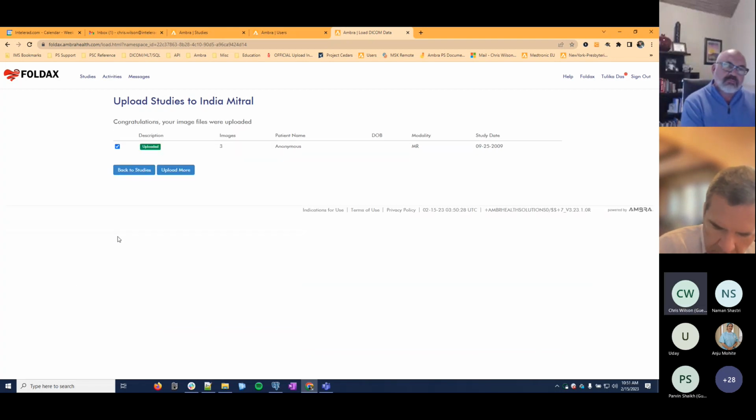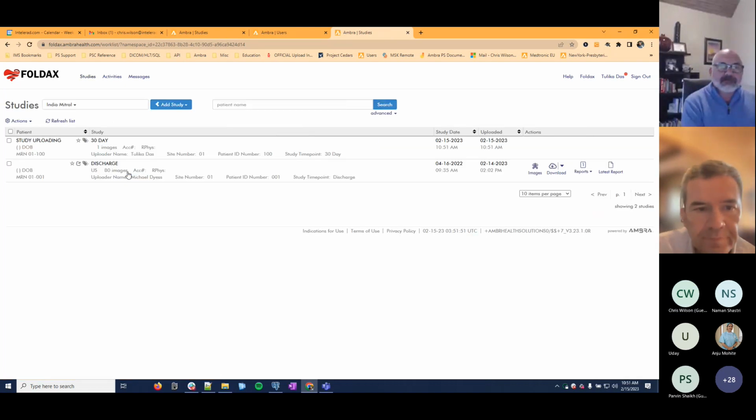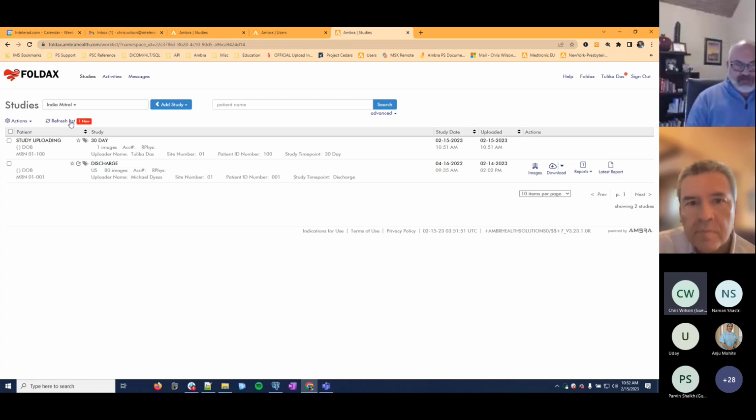Once you hit upload study, you want to wait until that progress bar gets completed and you actually get an uploaded congratulations message. At that point, when we go back to studies, you're going to see your study beginning to upload here. You can sit on this page and wait for it to refresh. You'll see an indicator that says the study has been successfully updated. So we have the one new.